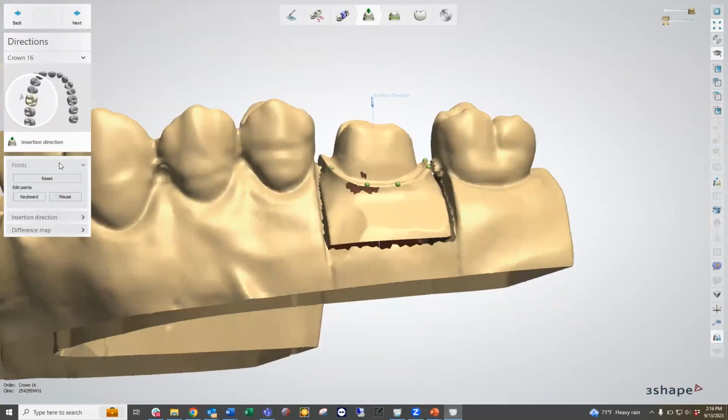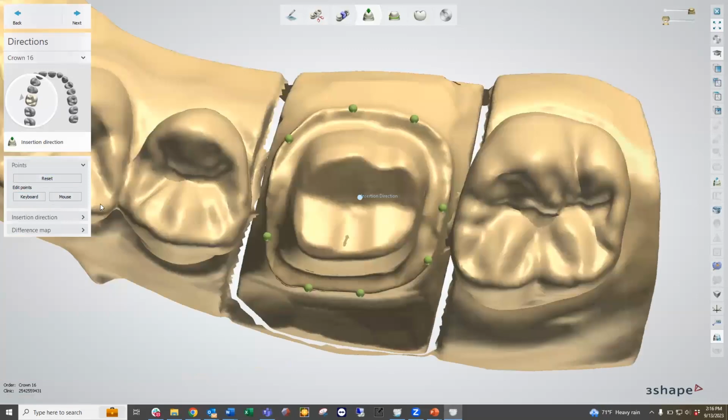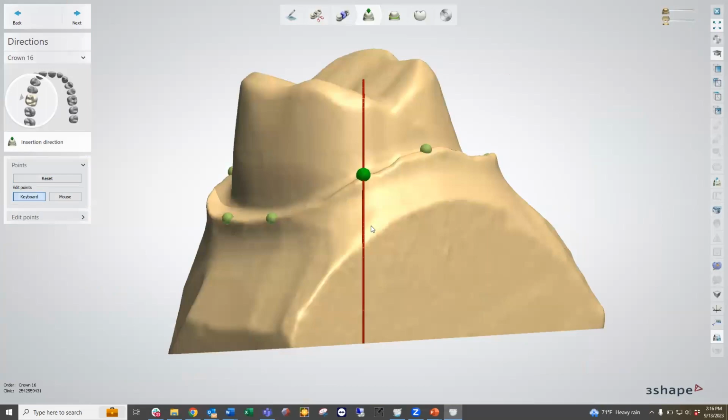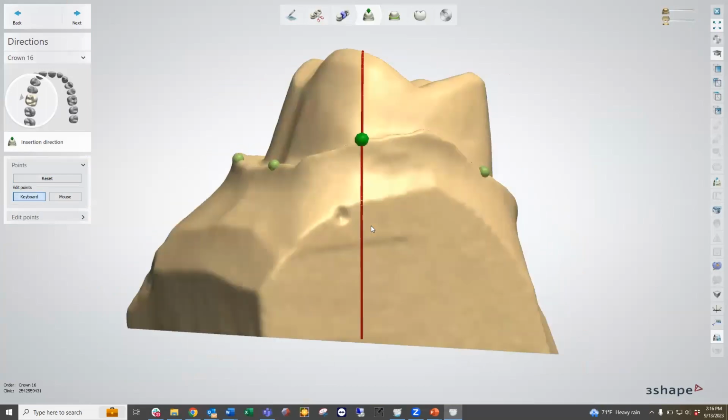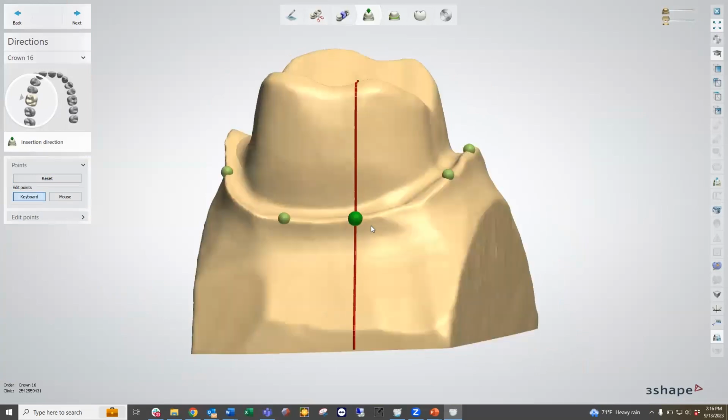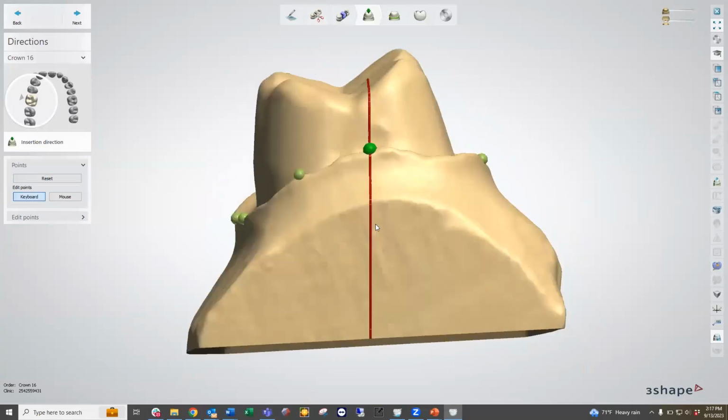Now, we can determine the insertion path by using points, by using a reset method, and we can use our keyboard or our mouse to edit the points around the margin line, which determine the best path of insertion based upon the curvature of that margin line. It does not take into consideration the axial walls or the neighboring teeth as relevant resources, but it just uses these points.